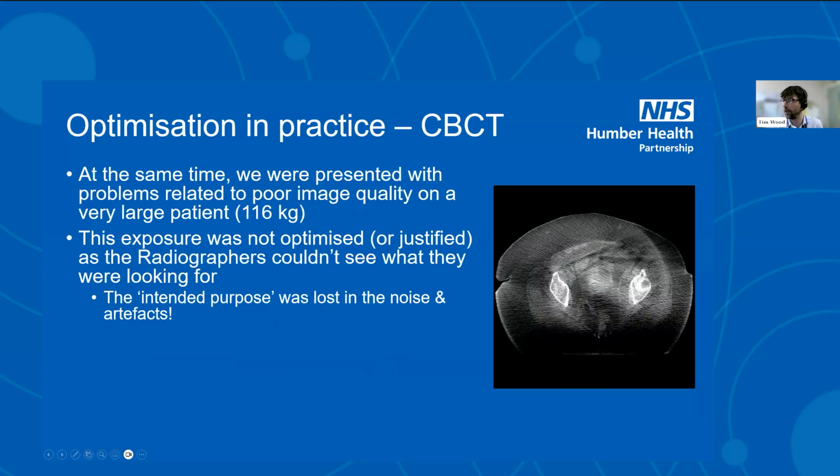Around the same time, we also had those patients that were problematic. And this is one of the things that always bugged me a bit at that time, that there was this culture of, here's a default setting, you hit it, you use it day after day after day, you just keep hitting the button. But then we start to get, having done that other work, well, we've got this patient and it's not quite good enough. And this was a very large patient at 116 kilos.